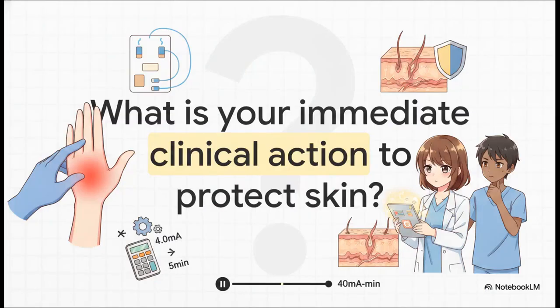All right, I'm going to leave you interns with a clinical scenario to test your reasoning. If a patient reports a painful burning sensation just 5 minutes into a 4.0 milliamp treatment, what is your immediate clinical action to protect their skin while still trying to ultimately complete that 40 milliamp minute dose? Review your math, prioritize your patient's skin integrity, think back to what we just discussed regarding intensity and duration, and I'll see you out on the clinic floor with your answers.